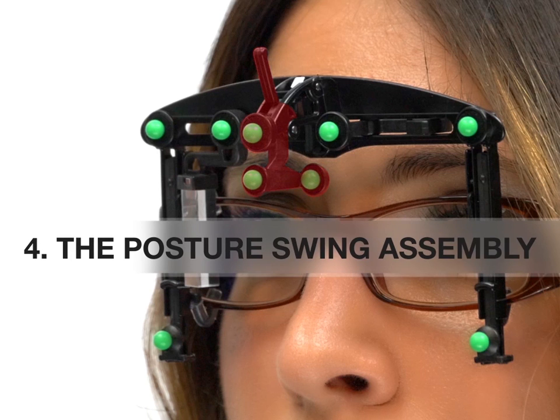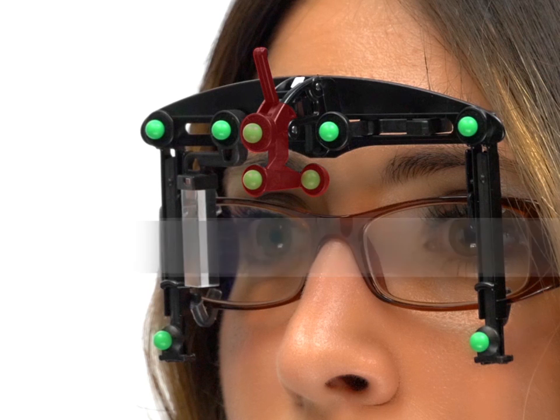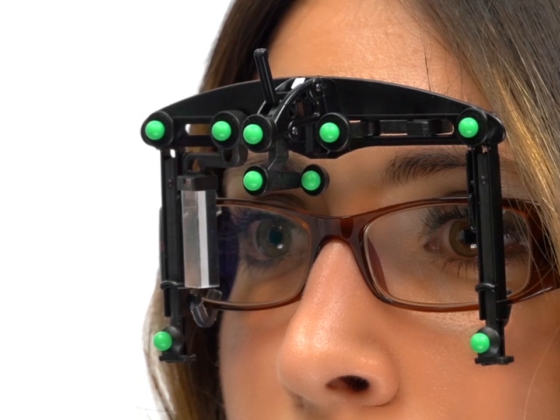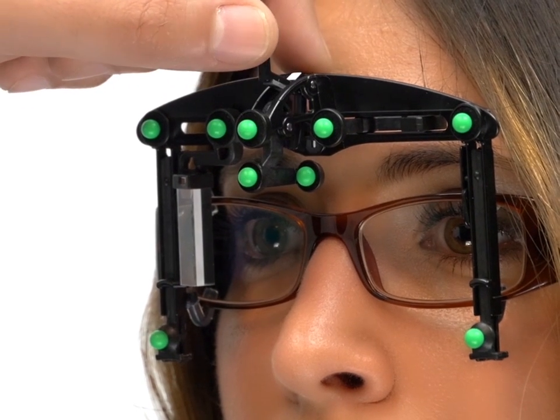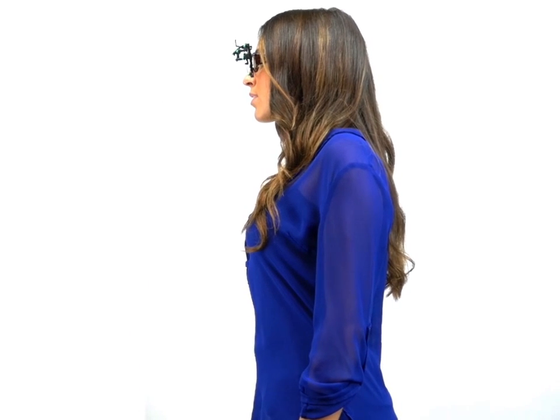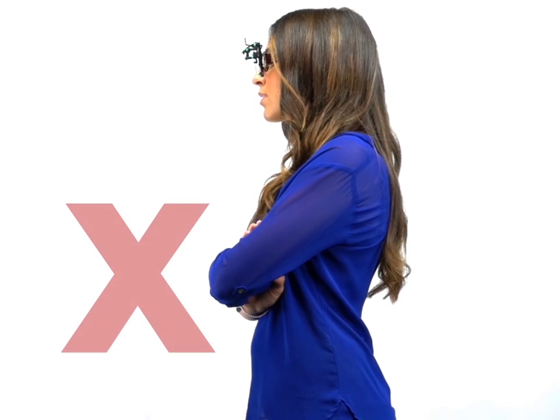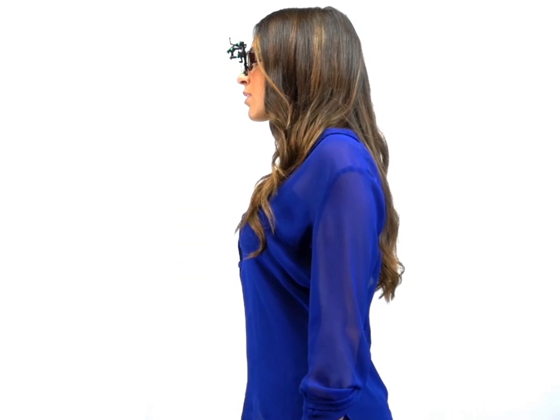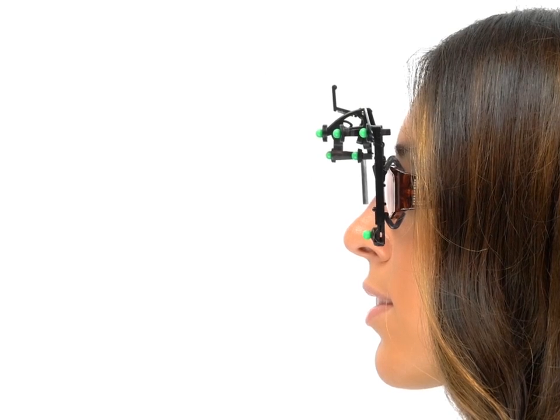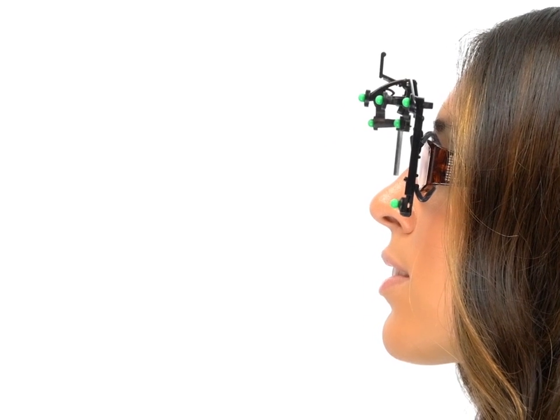The patented posture swing assembly allows the height measurements to take into account the patient's natural posture. First, unlock the swing assembly by lifting the brake arm. Next, make sure that the patient assumes their natural posture. Note that the patient should not be crossing their arms during this step. You can either capture the patient's standing posture or their sitting posture based on the patient's lifestyle. Ask the patient to look at a far distant object using their primary line of sight.